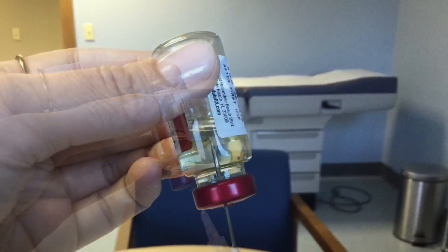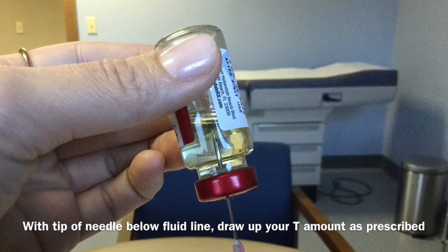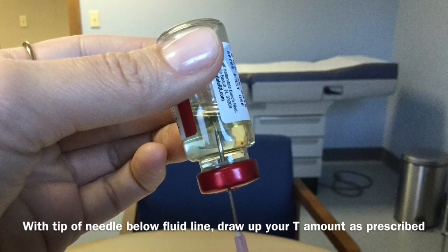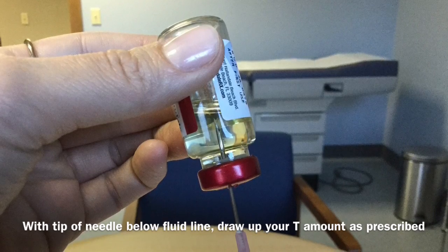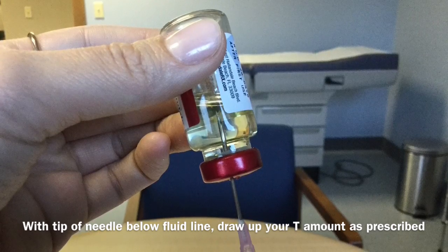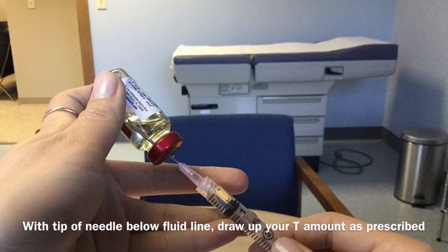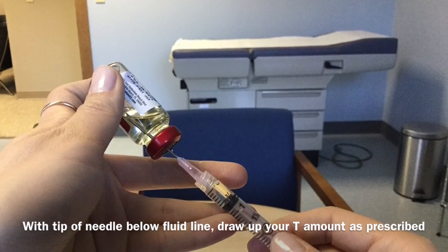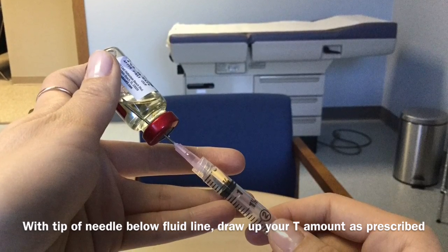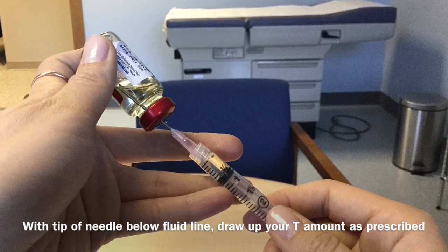Next, with the tip of the needle under the fluid line of the testosterone and the testosterone vial upended, you'll go ahead and draw back the amount of testosterone you've been prescribed by your physician. It's important to know this amount varies from the video, and also that you can adjust the amount of testosterone in the vial. As long as you keep the needle tip in the vial, it's fine. You can pull back on the syringe, push in and pull back until you adjust, get the air bubbles out of the needle and syringe, and you have a perfect syringe of testosterone.